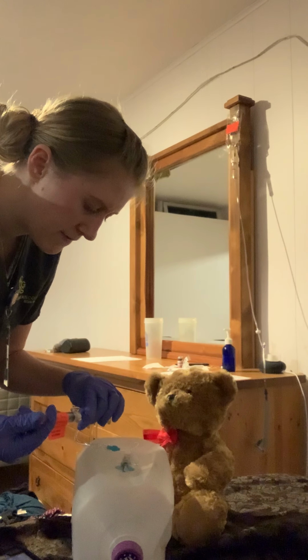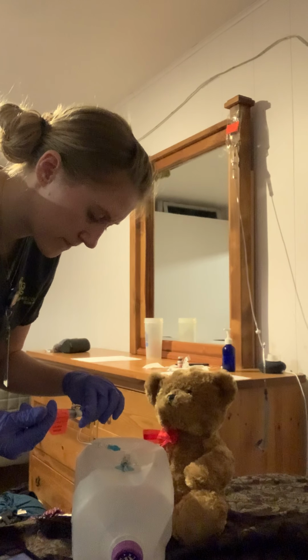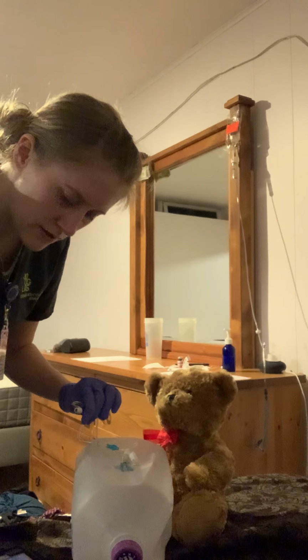Now at 45, and we'll do the last mil. And that's a minute. So that's all of it. Twist that off.